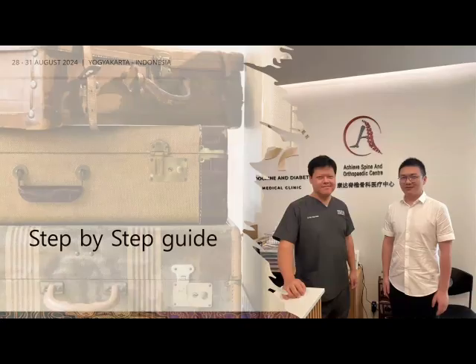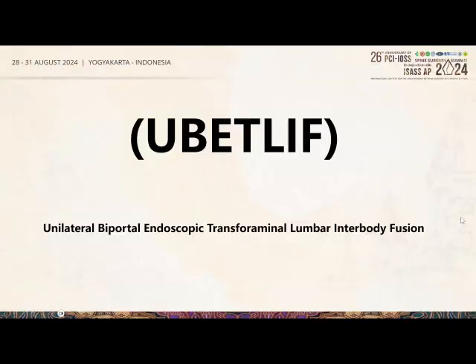In this step-by-step guide, I would like to credit my international fellow from China — Dr. Wu Chun Shui from Nantong — as some of the slides are prepared by him. This is essentially a step-by-step guide on UBE TLIF.